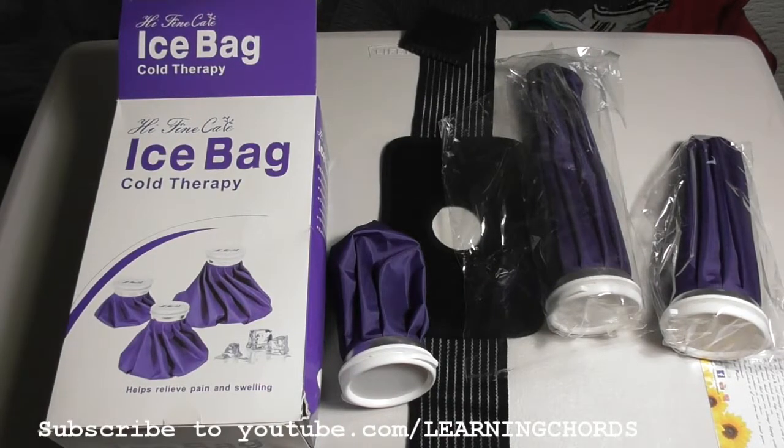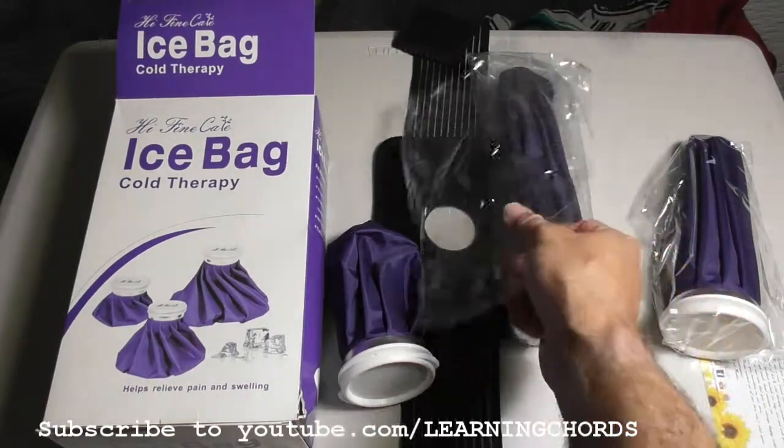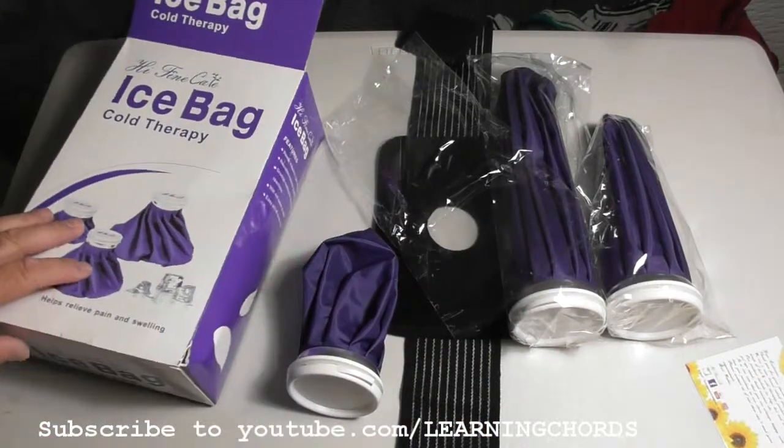This video is going to be a product review of the Hi-Fine Care Ice Bag. It comes in three sizes: 6 inch, 9 inch, and 11 inch. You might think that's ridiculous, but it isn't, because you're going to use all three of them — you'll definitely use the different sizes for different parts of your body.